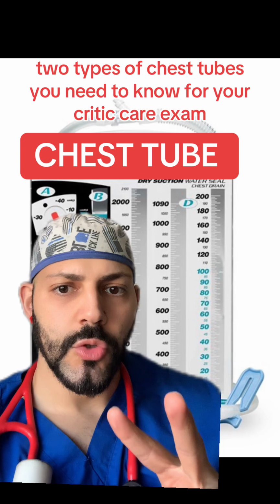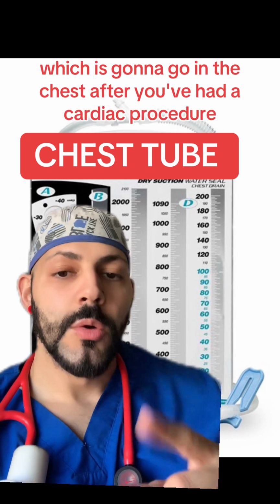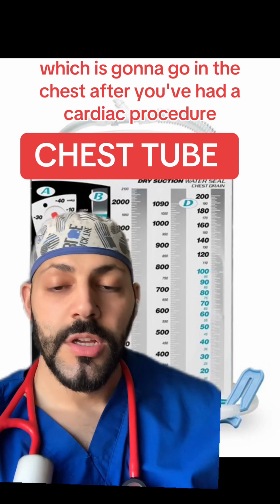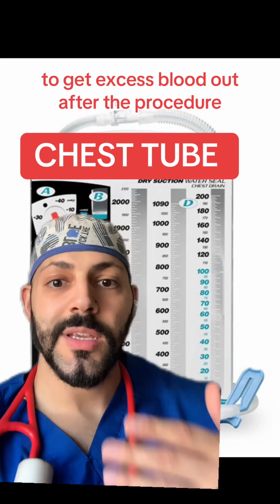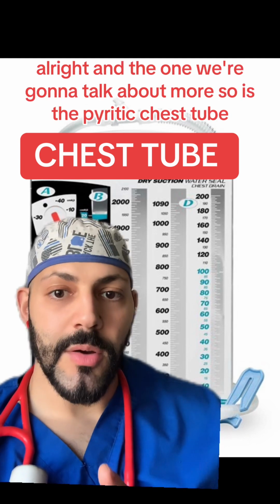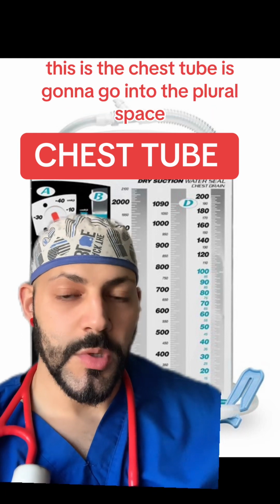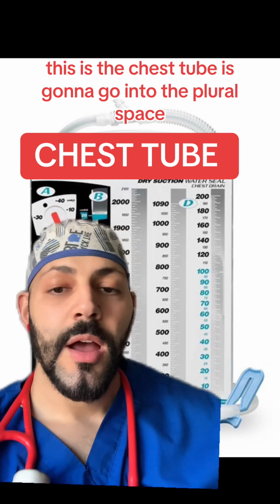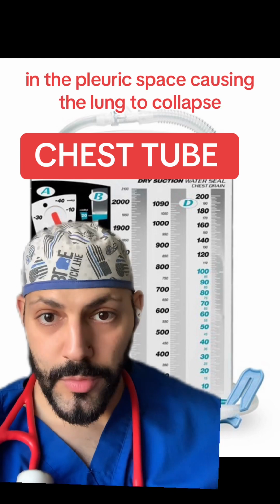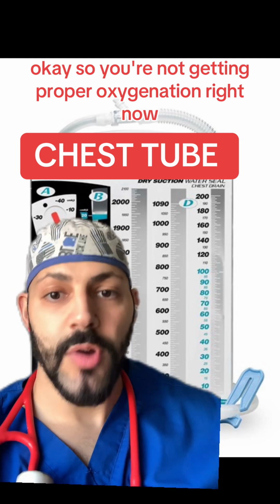Two types of chest tubes you need to know for your critical care exam is your mediastinal chest tube, which is gonna go in the chest after you've had a cardiac procedure. It gets placed into the pericardial space to get excess blood out after the procedure. All right. And the one we're gonna talk about more so is the pleuritic chest tube. This is the chest tube that's going to go into the pleural space because you have air and or blood in the pleural space causing the lung to collapse. Okay, so you're not getting proper oxygenation.